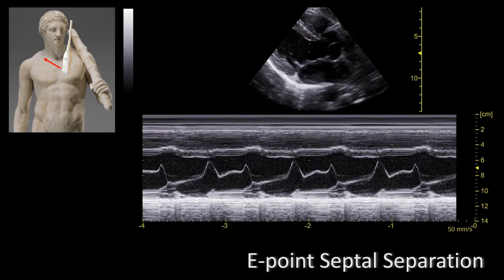Let's identify the structures. Starting from the top, you first come across the right ventricle, and that corresponds to this cavity over here in your M-mode tracing. Then you have the septum and you have the left ventricular cavity. In the middle of the left ventricular cavity you have the mitral valve leaflets.